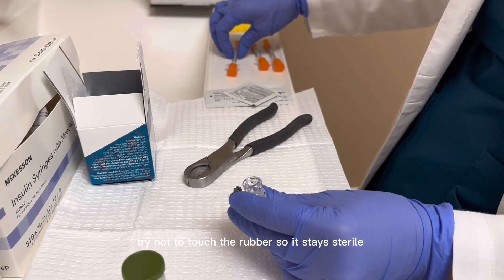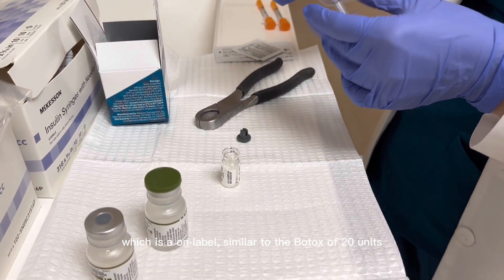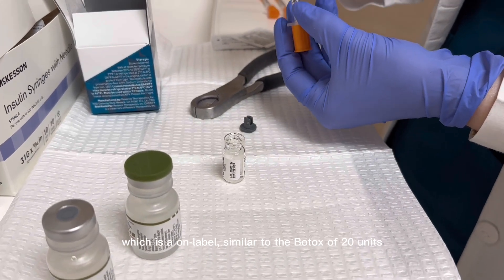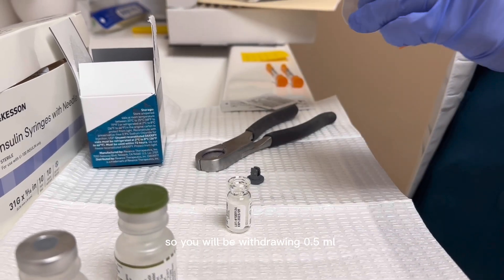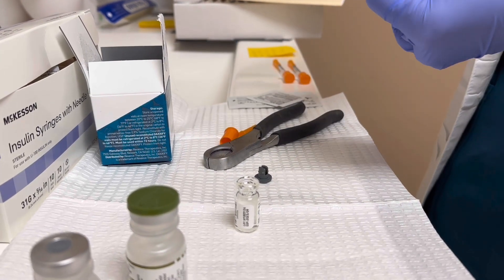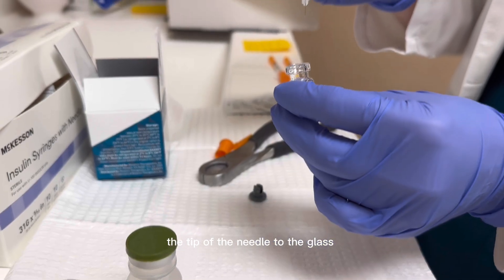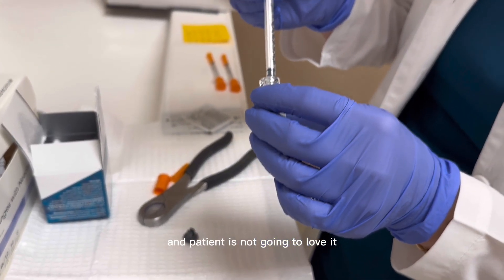Try not to touch the rubber so it stays sterile. For glabella, which is on-label, similar to the Botox of 20 units, you will be withdrawing 0.5 ml in your regular Botox syringe. Make sure that you don't touch the tip of the needle to the glass, because it will dull the needle and the patient is not going to love it.